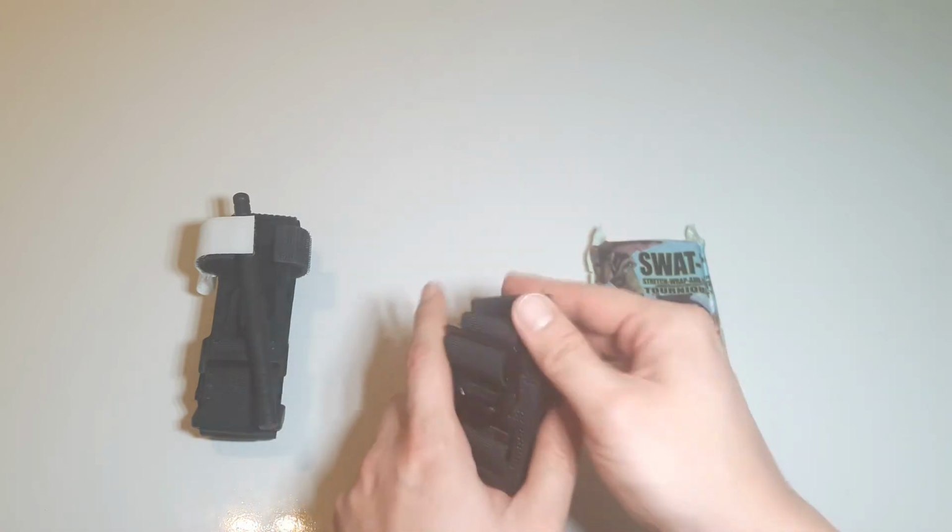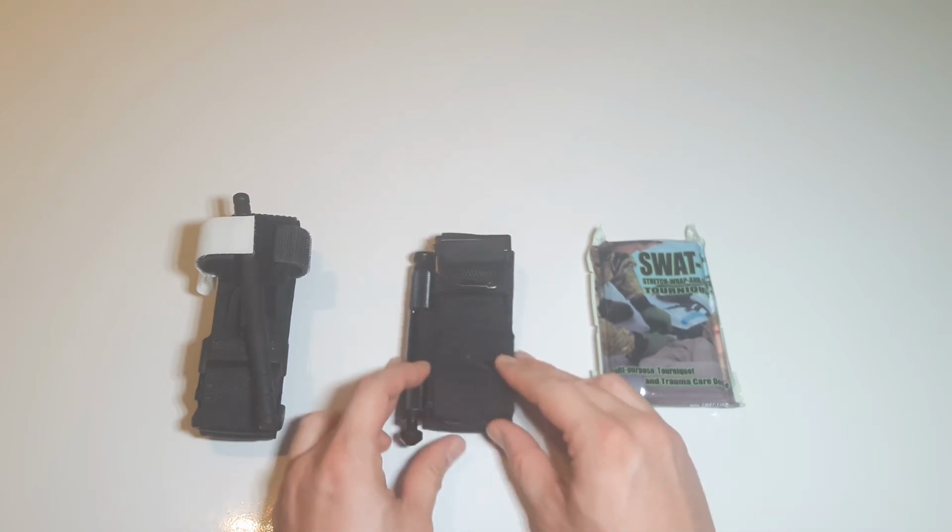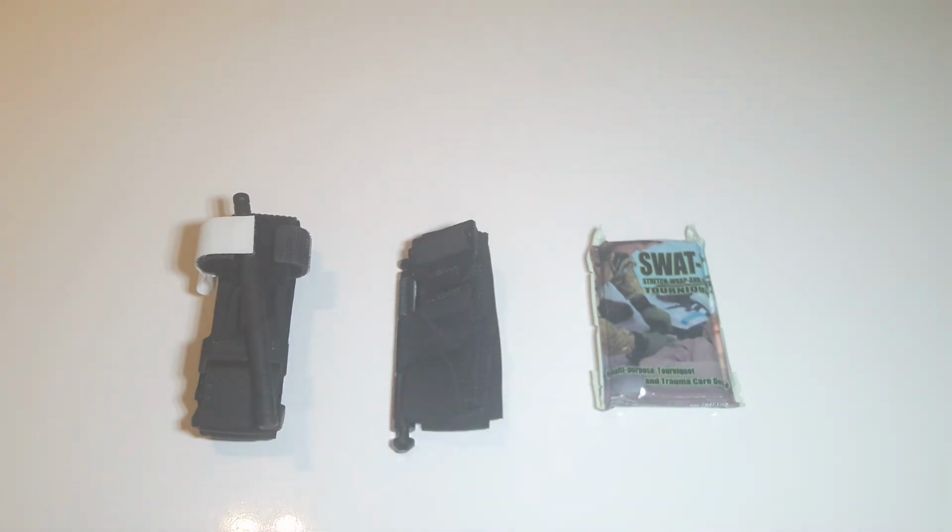I have practiced with it and it functions well, and since it doesn't use any plastic parts with the exception of the windlass lock, I think it will be just as reliable. The only criticism I have against the SOF-T is that it might be hard to get the windlass in the plastic lock once it has been tightened.